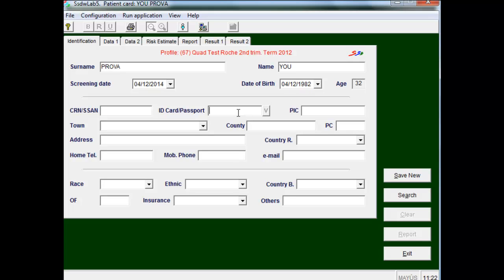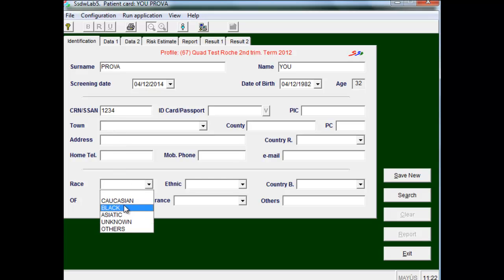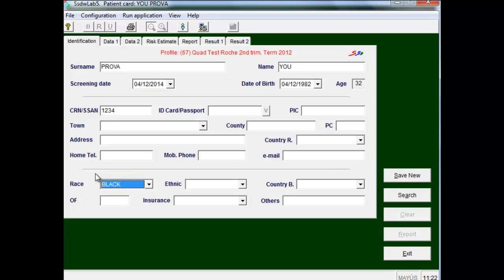It is advisable to introduce a code identifying the patient, such as the number of medical history. Then we introduce the patient race, that is a correction factor. In this case the race of the patient is black.